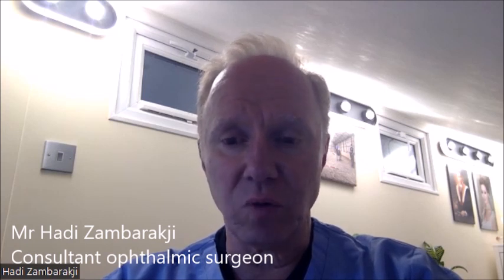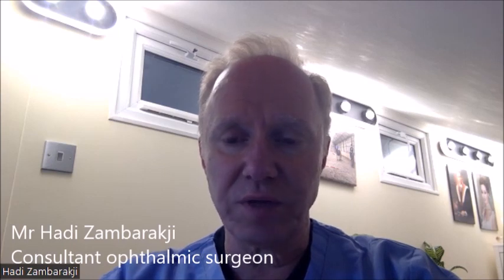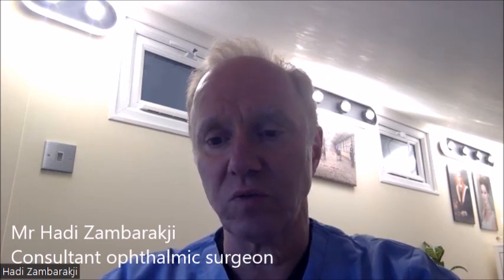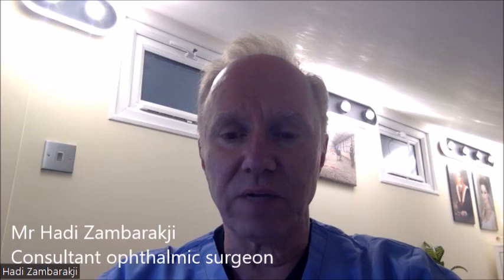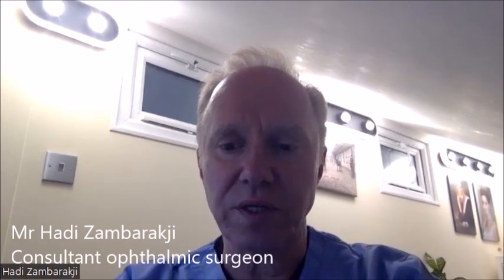Now, the more modern trifocal type of lens implants, which are effectively a type of multifocal lens, are designed to give improved vision at distance, intermediate, and near. And there are other lenses available that are supposed to give you a continuous range of vision, which means they're trying to mimic essentially a young natural lens, therefore providing clear visual acuity at any distance.